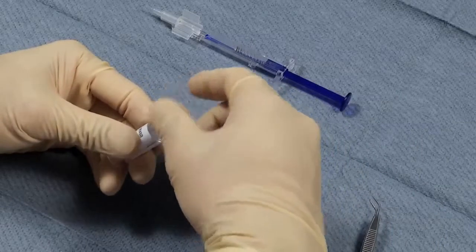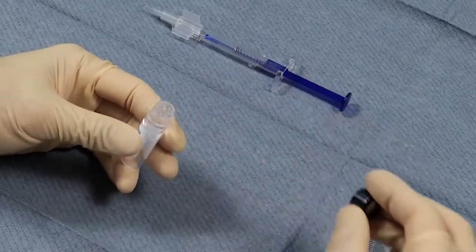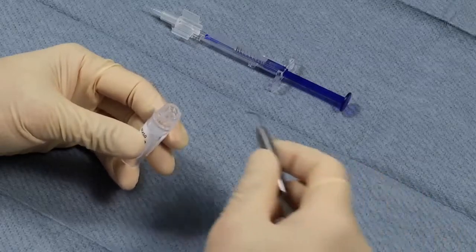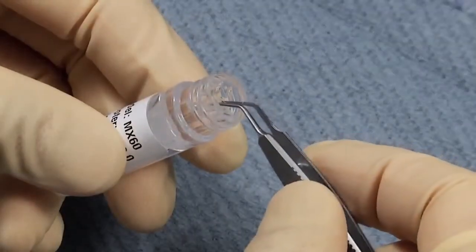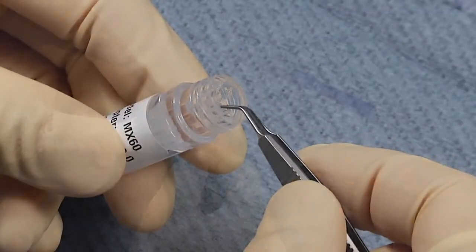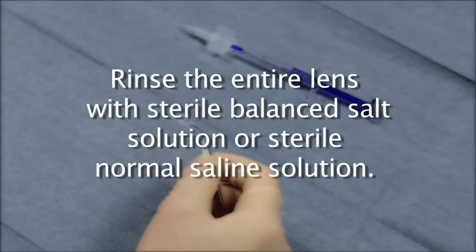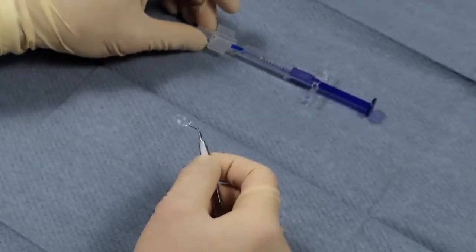Open the vial containing the IOL, and using non-serrated forceps, remove the lens by grasping and carefully pulling it out vertically from the center slot at the top portion of the vial. Rinse the entire lens with sterile balanced salt solution or sterile normal saline solution.